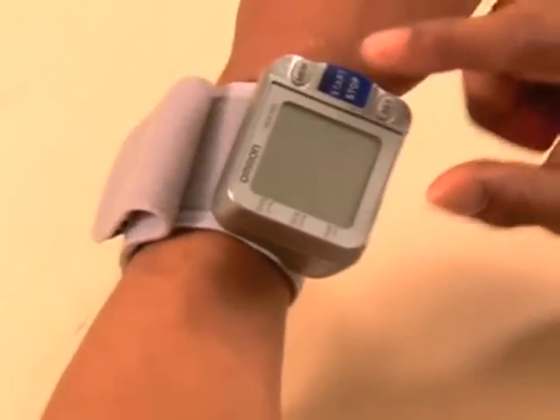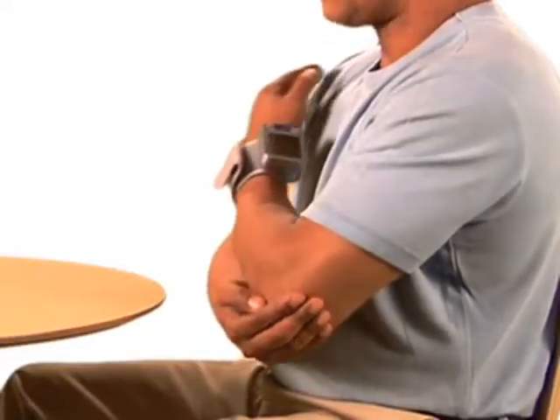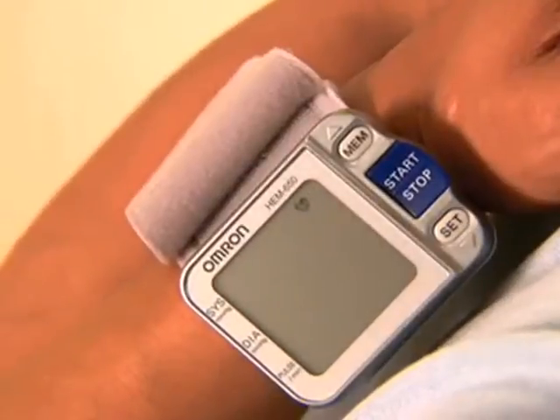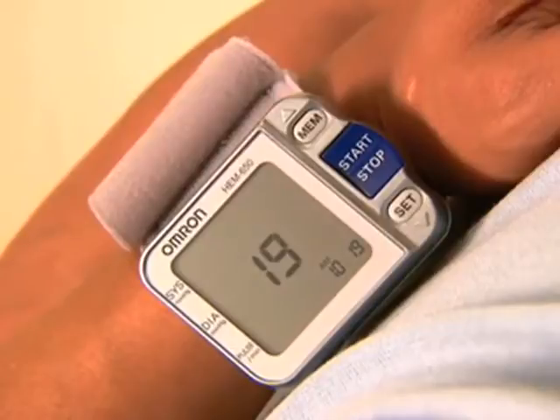To turn the unit on and take a measurement, press the start-stop button once. The monitor will start beeping. Holding your left elbow and arm against your body, elevate your wrist to heart level. The monitor will beep faster as you get closer to the heart zone. Four slow beeps will sound when the unit is in the correct position.